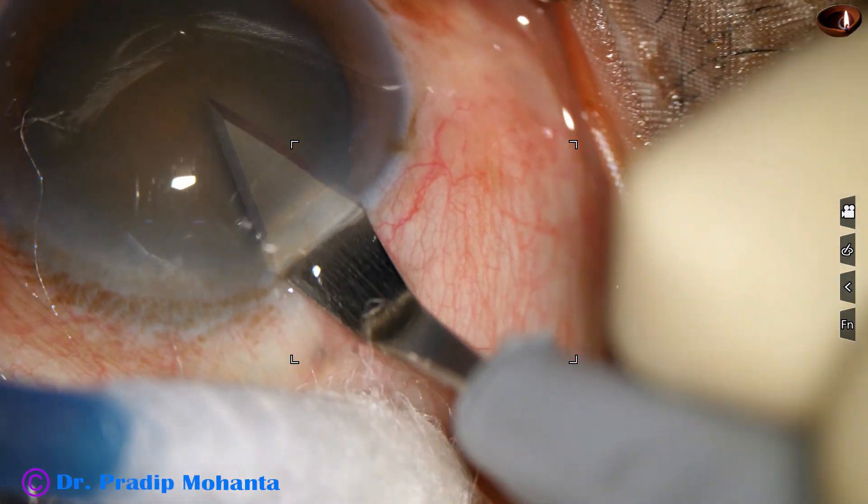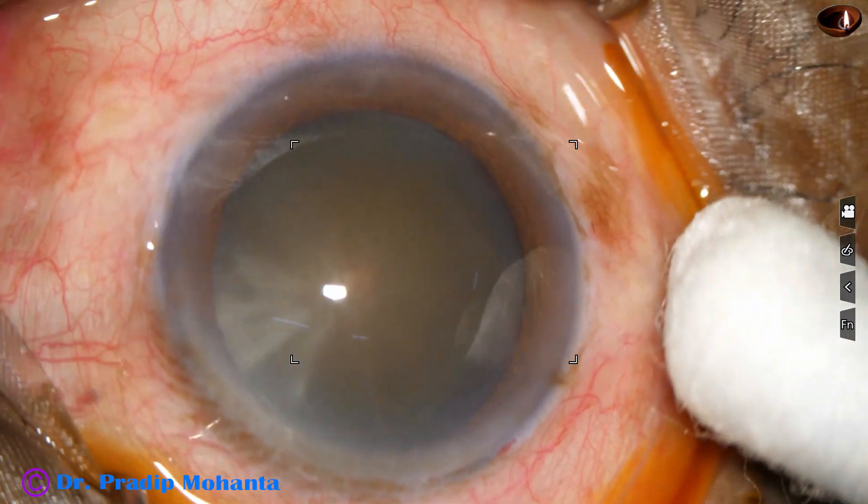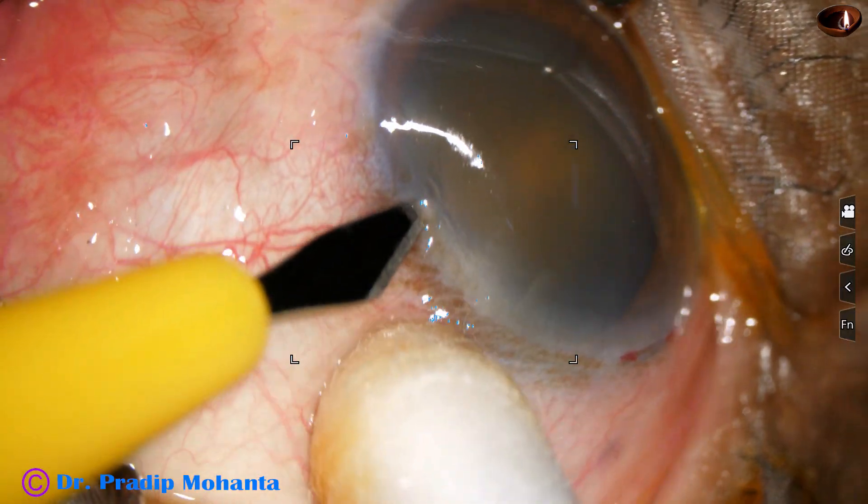This is the main incision. And now a sideport is being made on the left side of the main incision, about 2.5 clock hours away.